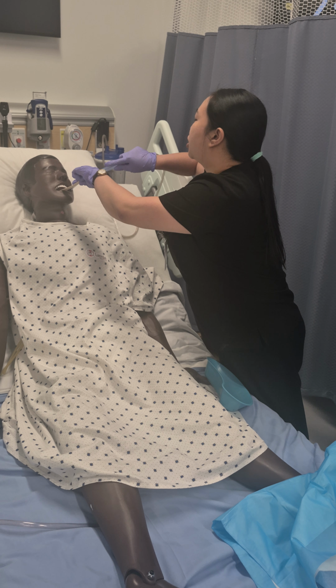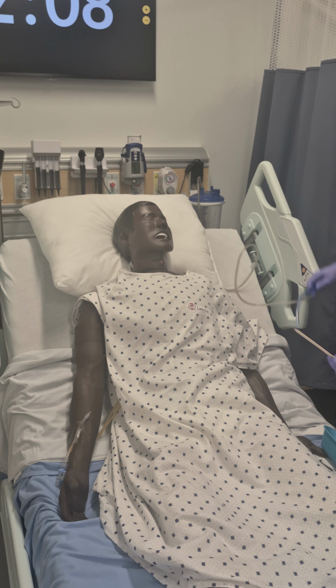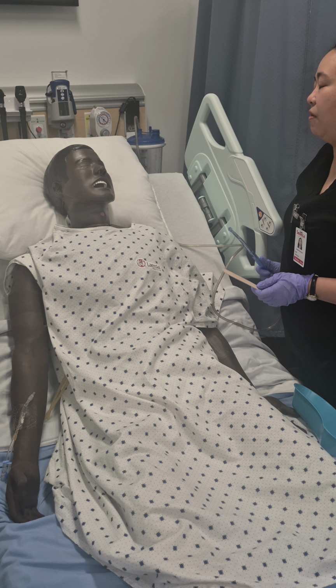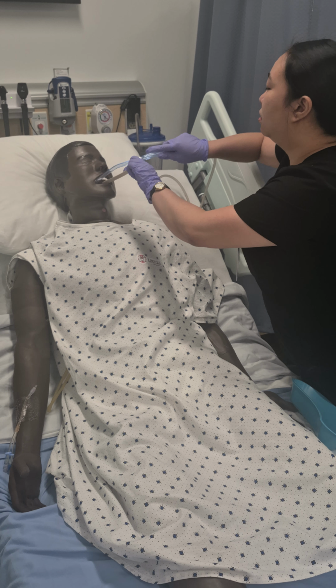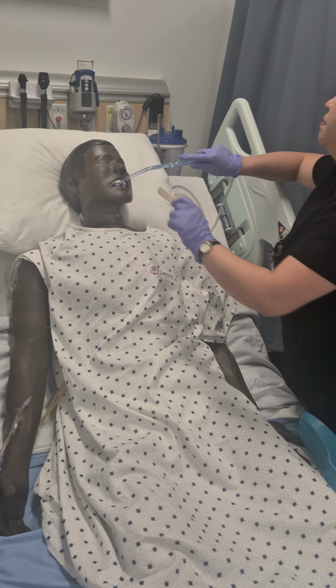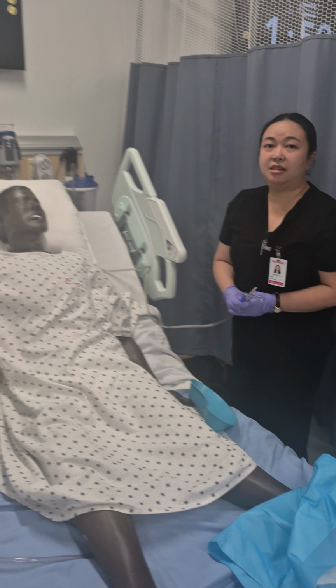I'll go each side of the mouth, under the tongue as well. Okay, then rinse out, and then I'm going to encourage him to do coughing. So can you cough? And there you go. I'll do suction again until all the secretion is removed and there's no more excess secretion present in the mouth. And that's done for the oral suctioning.